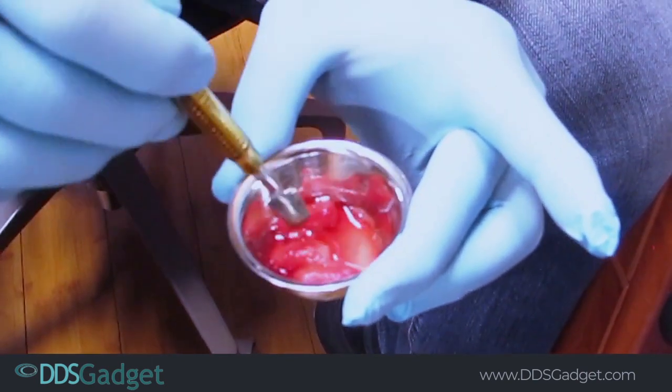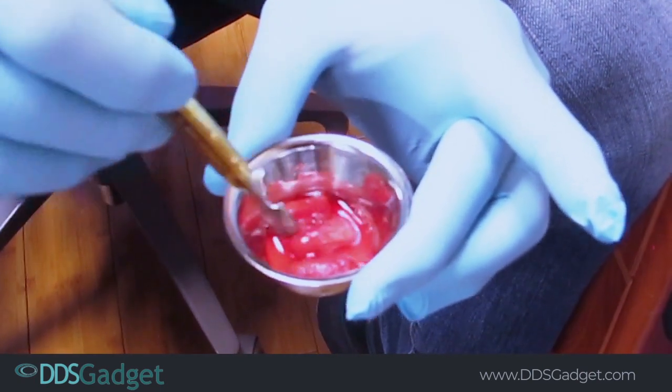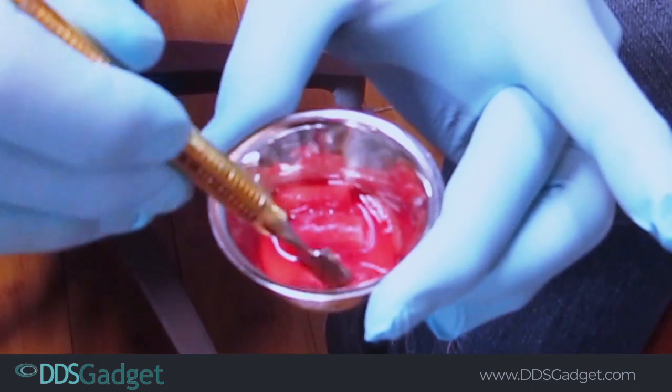You can also do this with bone and make a bone sandwich with PRF wrapped all around — this is essentially like jello, so it's going to gel up here in just a bit. I'm also going to put one of the PRF pieces in here to speed up the process, and we're going to let this sit for a few minutes. It should gel up in about three to five minutes.